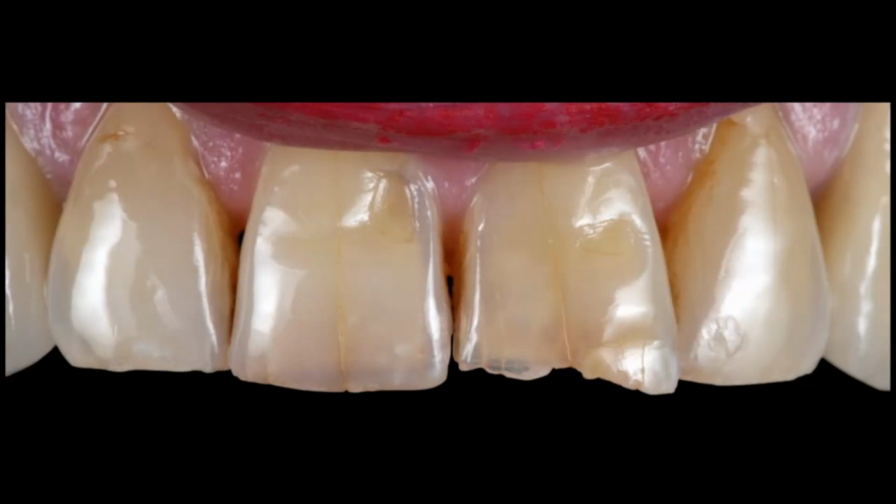As you can see, even older teeth of this 75 years old lady is in the range of an inherent aesthetic outcome. But she complained about the length of the teeth, about the shape and the shade of the teeth, so we can change it in the future.